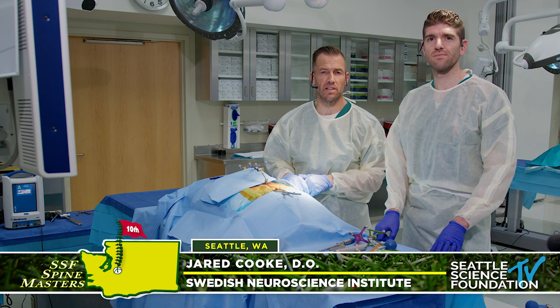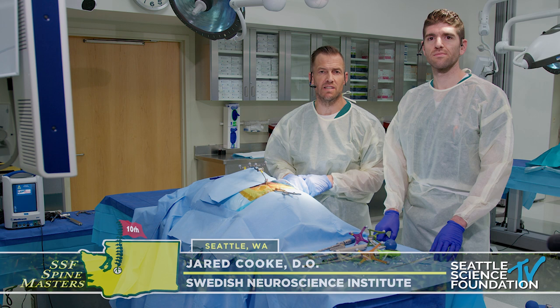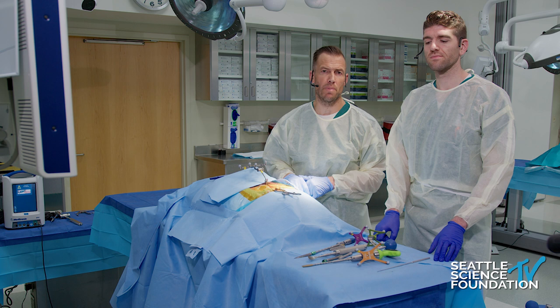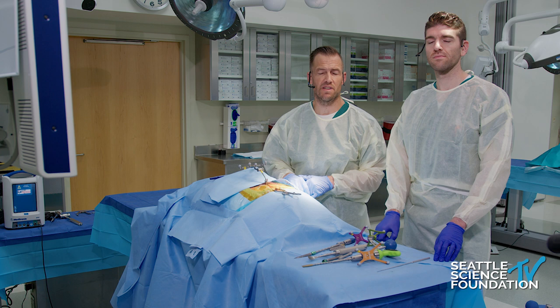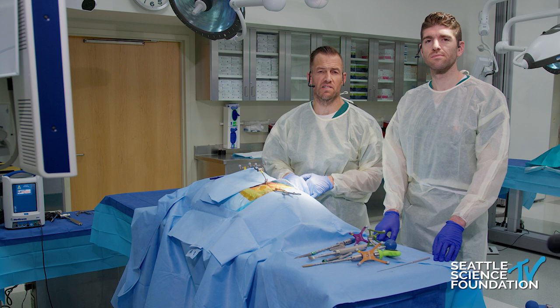I'm Dr. Roland Kent, here with Dr. Jared Cook, and I want to thank the Seattle Science Foundation for this opportunity. Apropos of the discussion we just had looking at augmentation of the iliac fixation and SI joint fixation, we want to explain how we do these in a practical sense. I want to thank Medtronic for supplying the O-arm and Stealth, and SI Bone for bringing these exciting new implants to demonstrate.